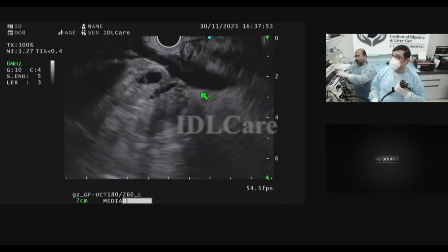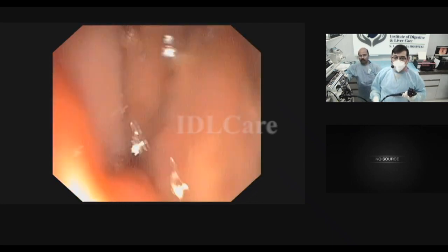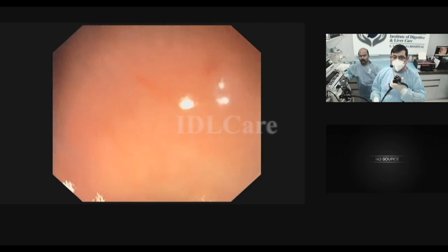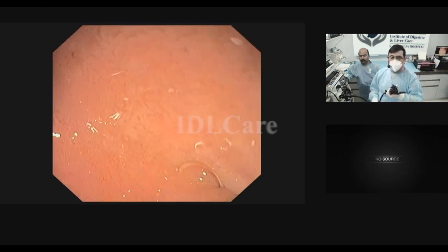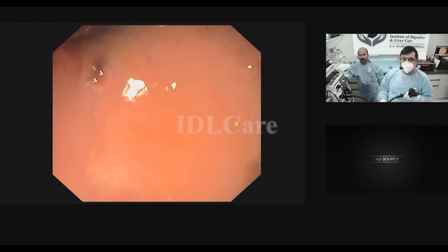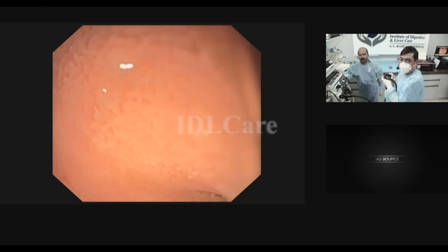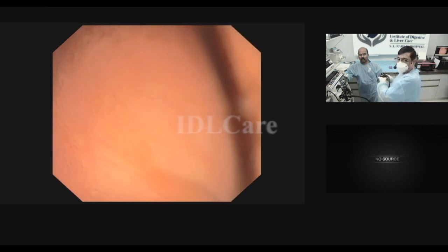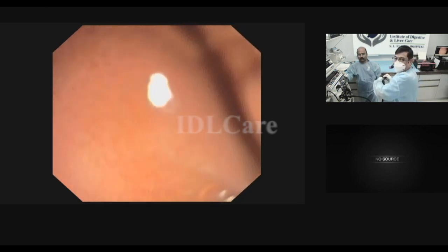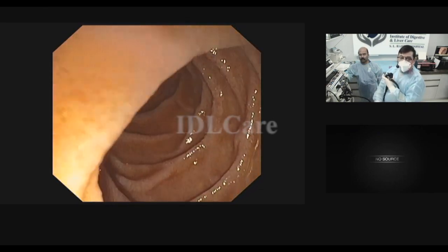We'll quickly do the D2 and see the endoscope. So the D2 is exactly like how you do for ERCP. Be very careful when you are going from D1 to D2, especially for the beginners, because you can perforate it. So do it under vision as far as possible, and if it is not possible, don't push yourself. So this is the D2.